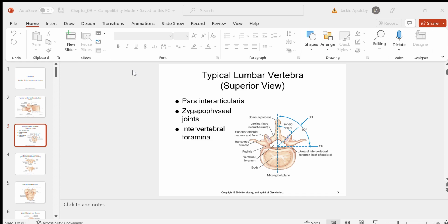So we want to know that angle, because one of our projections is going to use it. We don't need to learn that projection, but it's important that we learn this angle. It would be used for a projection, it's just not going to be one of our essential ones.